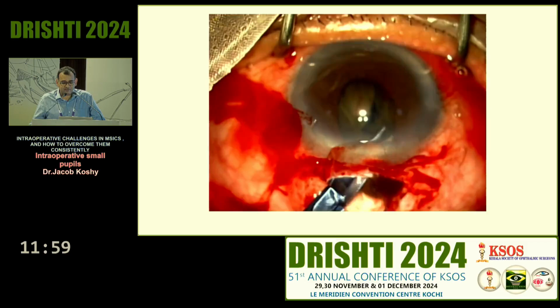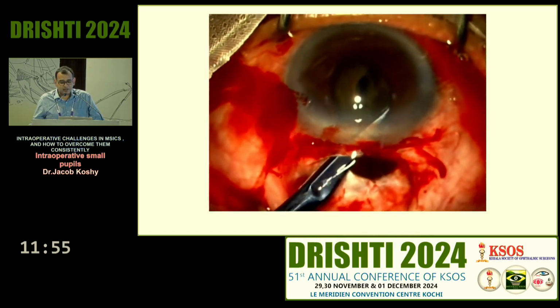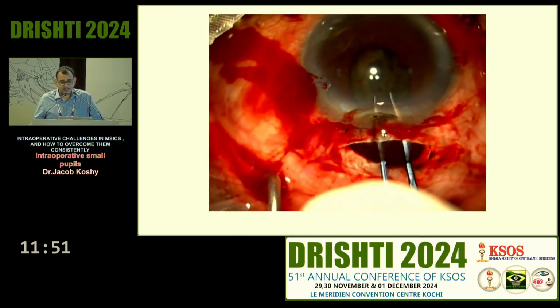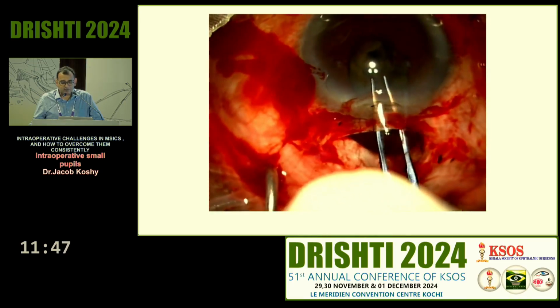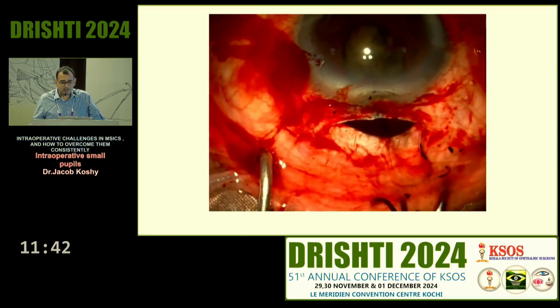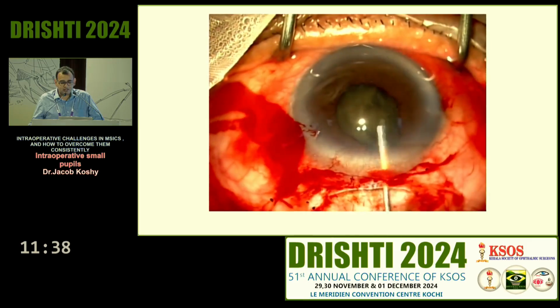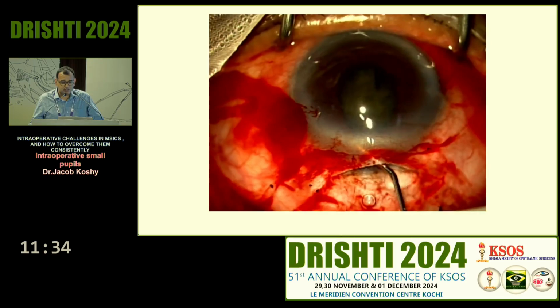At this stage, I leave the iris alone. I don't manipulate too much. I'm going in with the Vannas, and I'm hoping to make a nick to try and complete the rexis. So try and do these procedures without manipulating the iris too much. And so I managed to finish that. Now I'm left with the difficult task of prolapsing the nucleus. Good hydrodissection is absolutely essential.